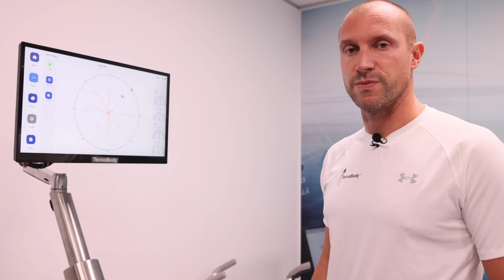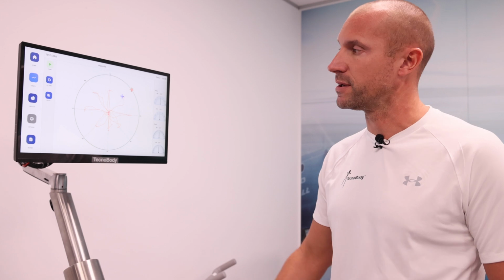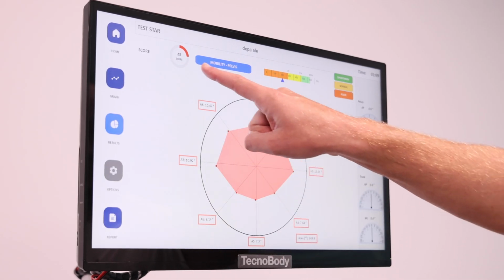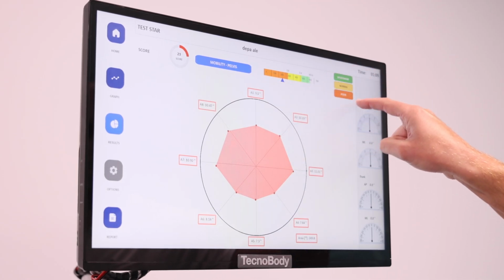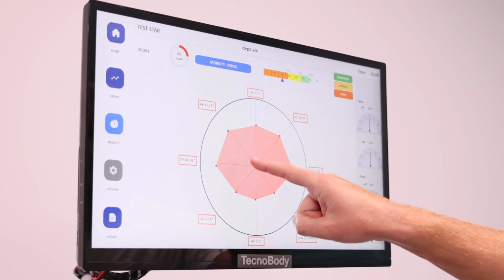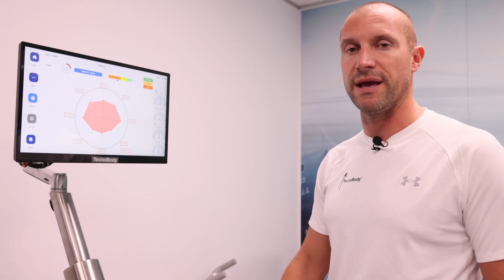After completing the assessment of the STAR test on the trunk module of the ProKin, we can get access to the results clicking on the Results button. Again, the score is based on the normative data that will be shown on the software. The normative data regarding the ability to have more or less range of motion. So again, the yellow zone means normal, red will be under the normal, and green will be above the average.